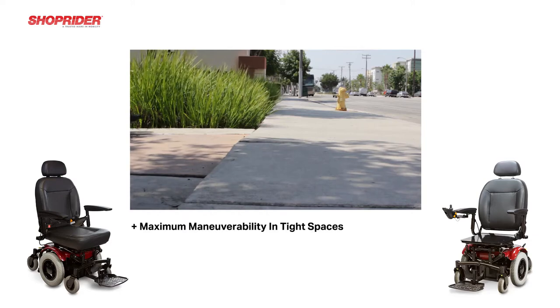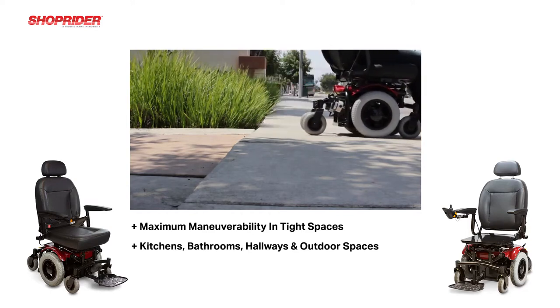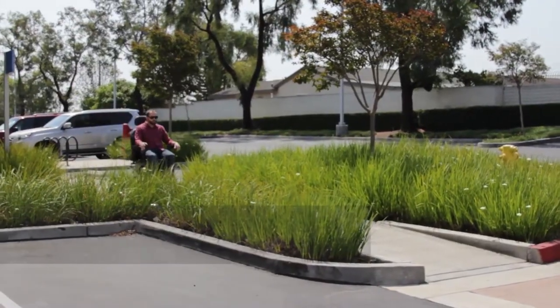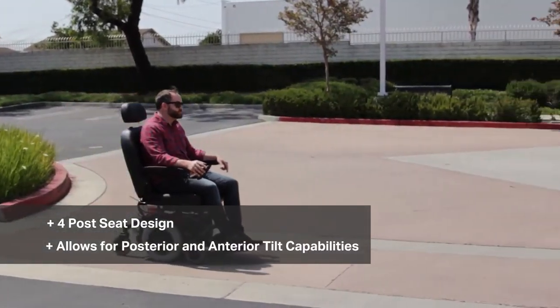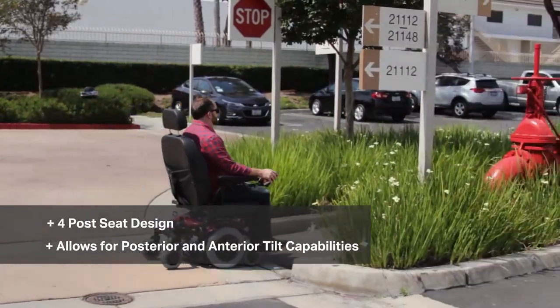The true mid-wheel drive offers maximum maneuverability in tight places such as kitchens, bathrooms, hallways and homes, or tight places in the outdoor environment. The 6Runner 14 has a four-post seat design allowing for fine-tuning of weight distribution, and also allowing for some posterior or anterior tilt capabilities if that's also a requirement.